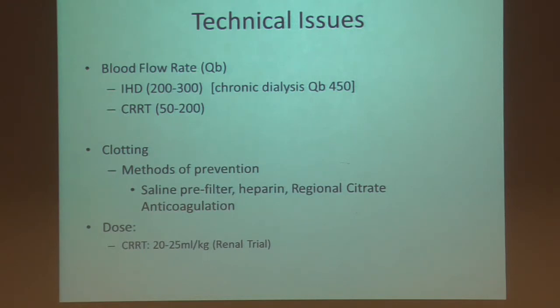But if you're practicing, you want to be very slow. If you're running blood flow at 50, it'll clot repeatedly, and then you're wasting blood, you're wasting supplies, you're wasting cost, you're wasting time, and you're not dialyzing the patient. So I like to run around 175 to 200.